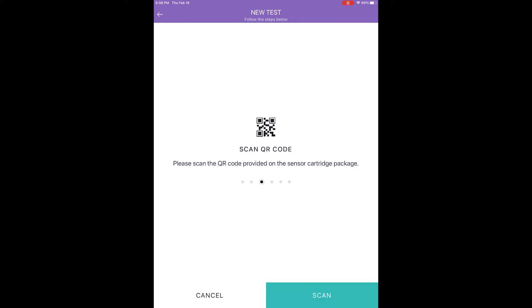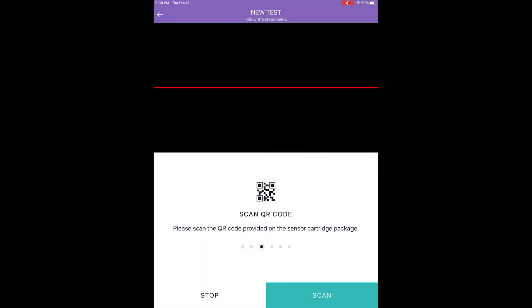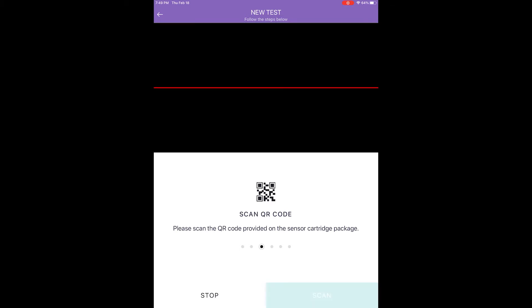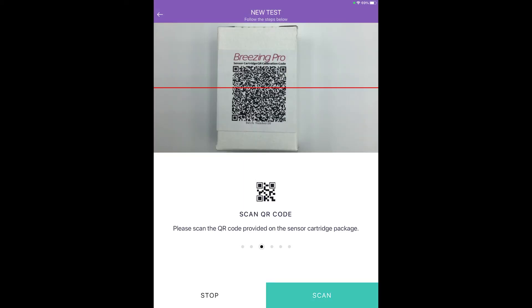Step five: Calibration. After the device is connected, scan the QR code provided with the sensor using the camera of the tablet. To do this, tap Scan to initiate QR capture. To capture the QR code, align the scan window with the QR code of the sensor so the app automatically captures the code and progresses to the next step.